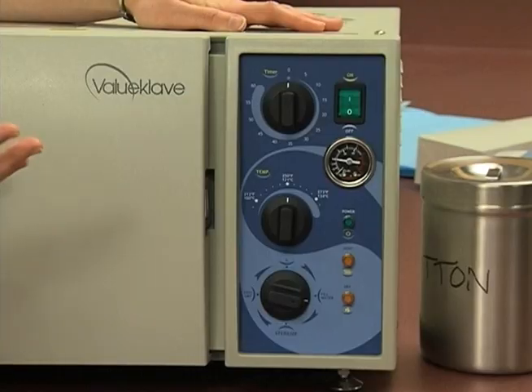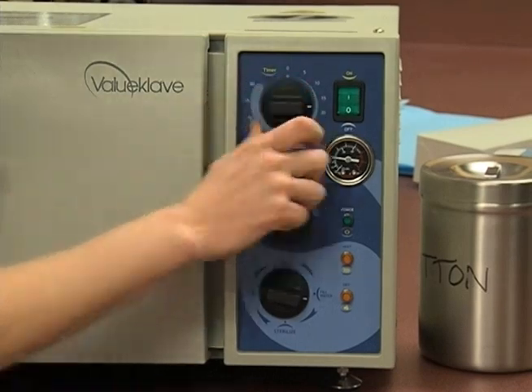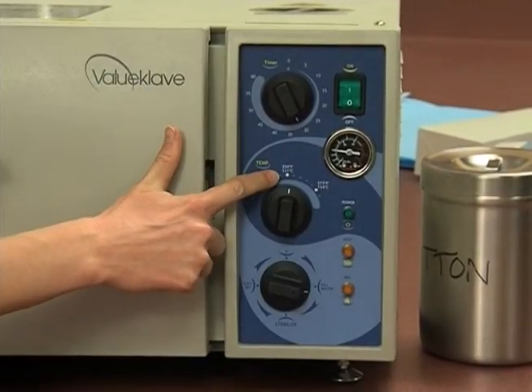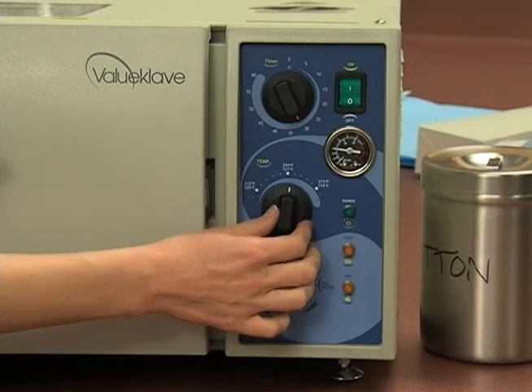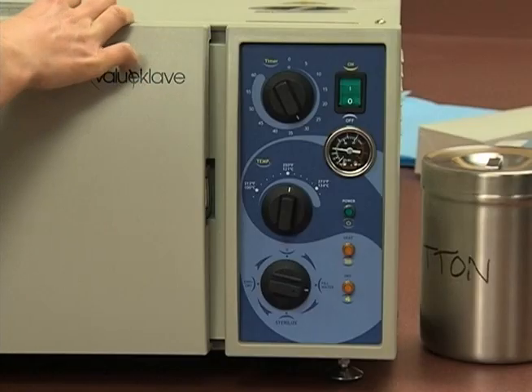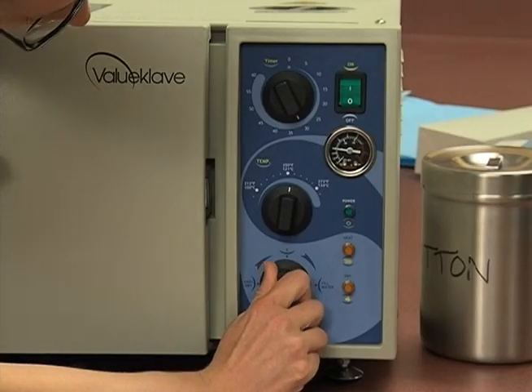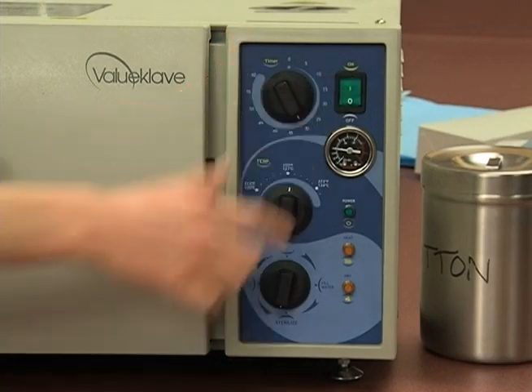Before we turn it on, we're going to get everything set. For general packs and wrapped items that need to be sterile for surgical procedures, we want to make sure that they've at least been sterilized for 30 minutes, so we could turn our dial to 30 minutes. We also want to make sure that they at least get to 250 degrees Fahrenheit or 121 degrees Celsius. The manufacturer will give recommendations for different types of wrapped items.